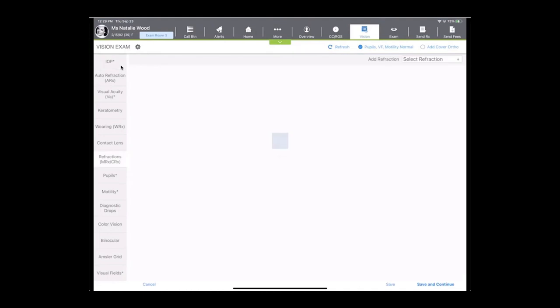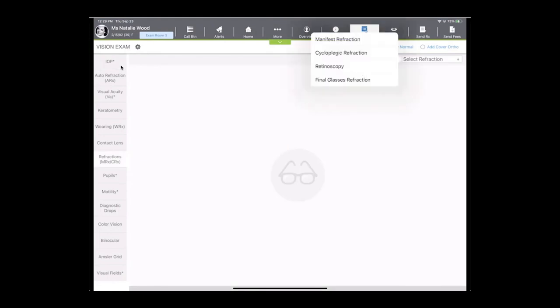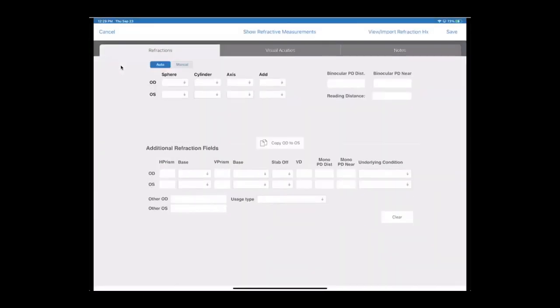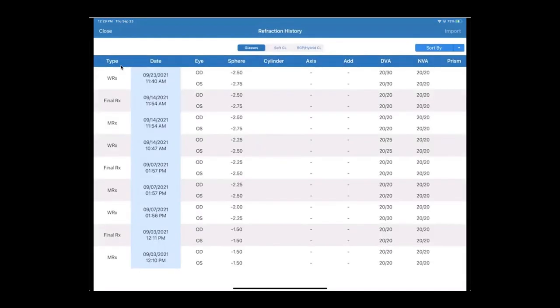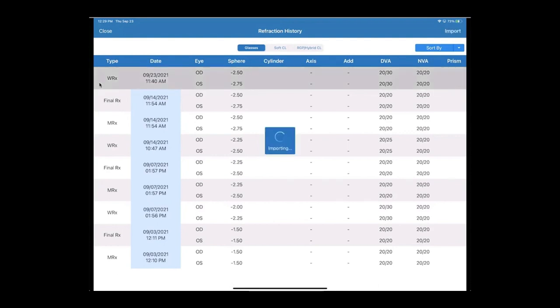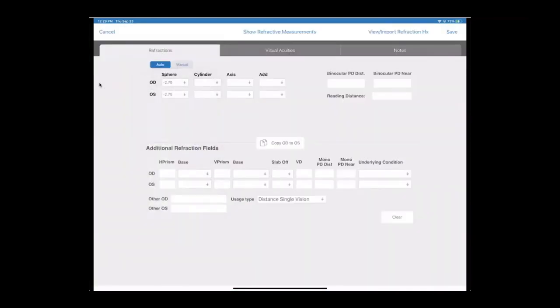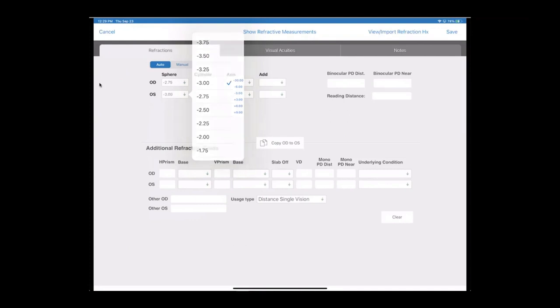Now with your refraction, down here at the bottom, you have the ability to load in refractive data to help you with speed. So if I want to load in what I just said the patient is wearing today, I'm going to grab that wearing RX and then adjust to fine-tune it for this year. This just really helps you with not having to toggle back and forth between screens and have all of your refractive measurements available to be imported into the system.